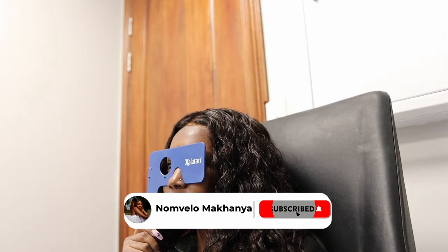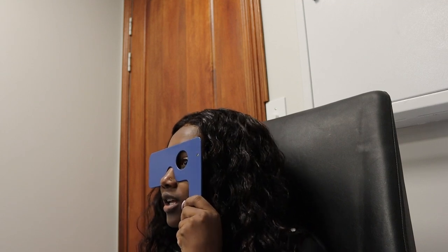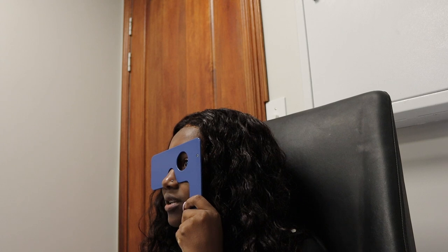Can you make out that letter? T. And those two? I think it's an O and a G. Those? Ooh. I think the one on the right is a Z. I have no idea what's on the other side. Other eye, so flip it over. Right there. I think that's an E. Anything there? I don't know if that's an S. O. Anything there? GH? I have no idea. I can't see anything.